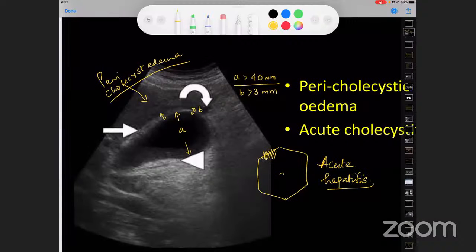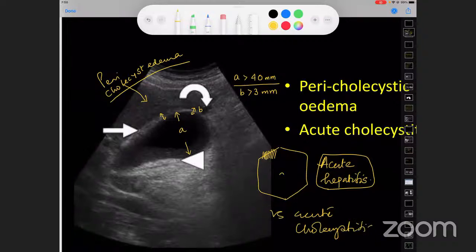It could have been a viral hepatitis also. Clinically, sometimes it becomes very difficult to distinguish because the patient is in pain. You don't get a very impressive history, and differentiating sometimes depends upon the radiological features. We'll start with Dr. Bakshi. Sir, any clinical things, or as a surgeon, how will you distinguish between these two?